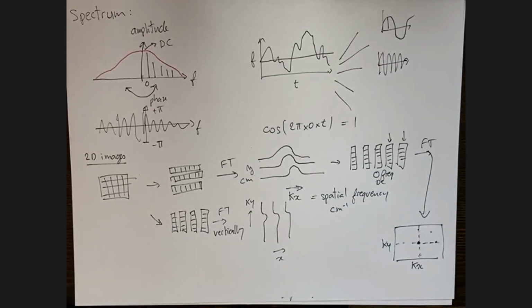And so this frequency information that's available through the Fourier transform is another way of looking at images. And when we reconstruct images, we'll see that we can actually derive mathematically a formula to reconstruct three-dimensional images from the measurements given by the scanner. So this is why this is going to be interesting.